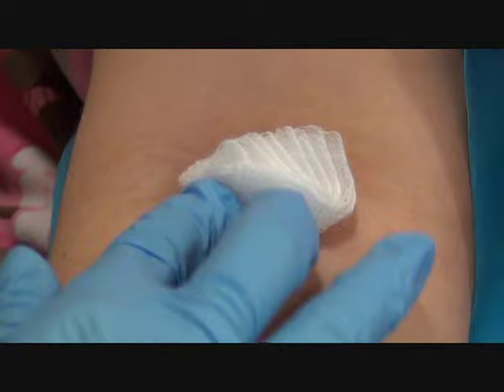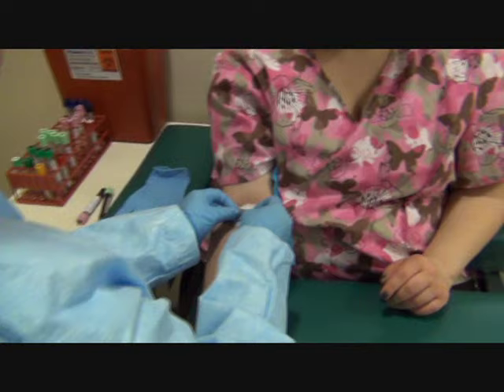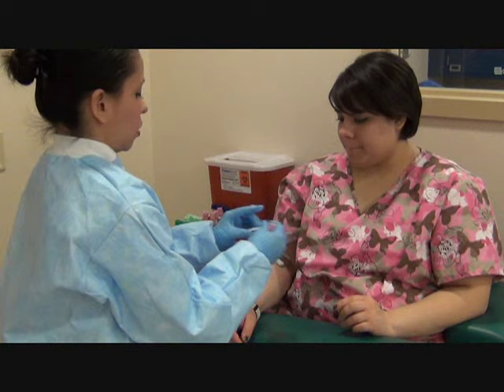Checking the patient's arm — are you on any blood thinners? No. Please apply pressure. Because the patient is not on any blood thinners, I'm going to use a bandage or tape depending on what the site has. Make sure you leave this bandage on for 15 to 20 minutes and no heavy lifting for the next two hours. Can you please verify that this is your name and your date of birth? Yes, it is. You feeling okay? Yep. You're all done. Thank you. Have a great day.